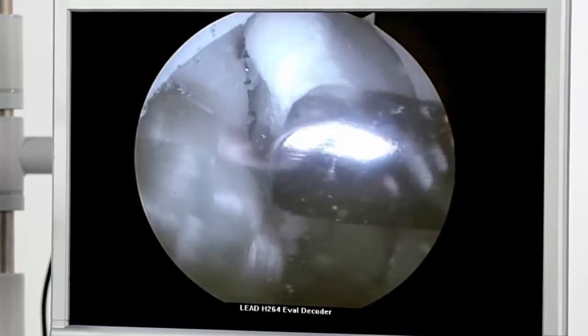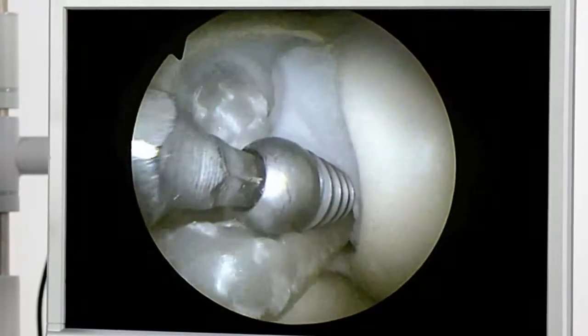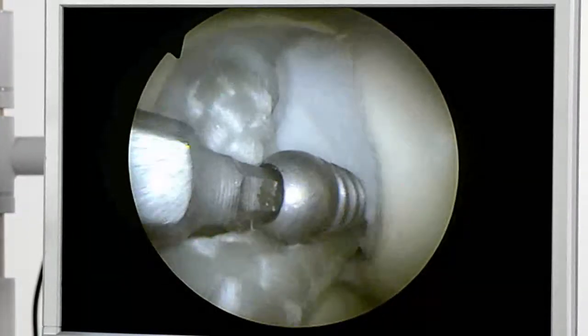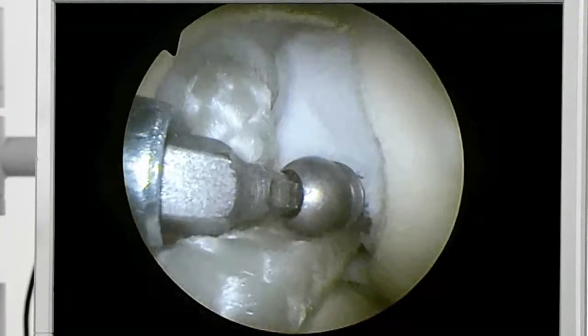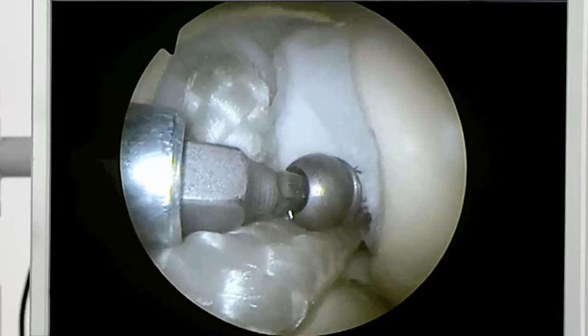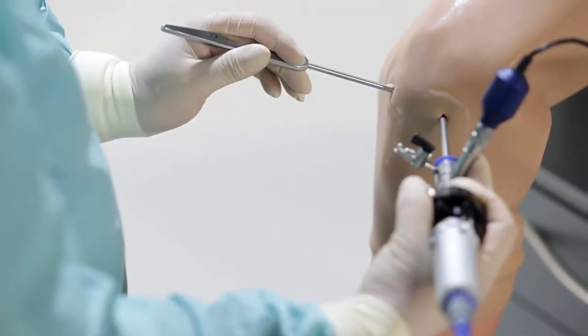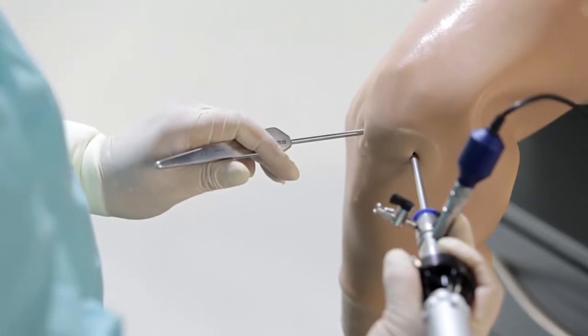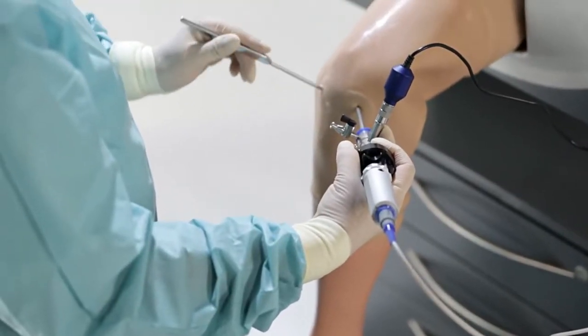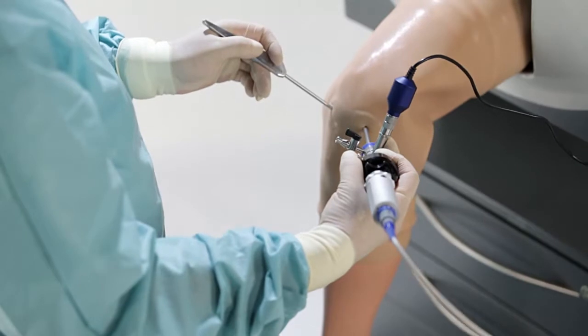The modular design allows for the simple addition of further materials — for example for cruciate ligament reconstruction techniques. The results can be objectively assessed in this case as well. The simulation is sufficiently realistic to teach and practice the surgical techniques involved in sophisticated minimally invasive arthroscopic knee operations.